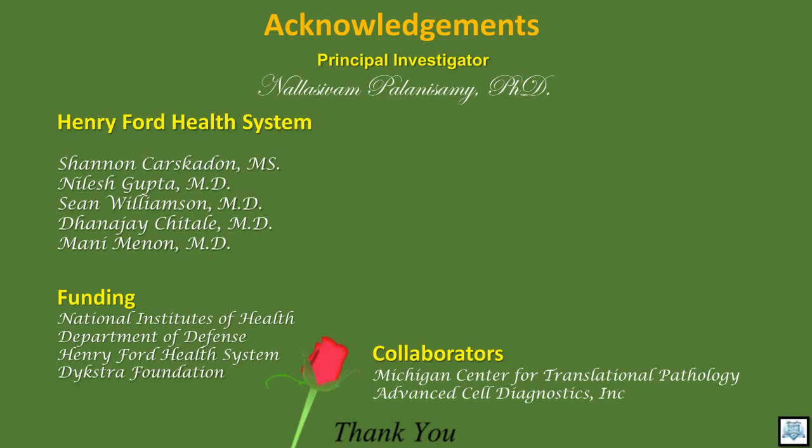Thank you. Our last question is, how long does the RNAscope assay take to perform? Normally you'll be able to complete the RNAscope experiment on the same day. If you start in the morning, by the end of the day you'll be able to complete the experiment. This is by the manual method.